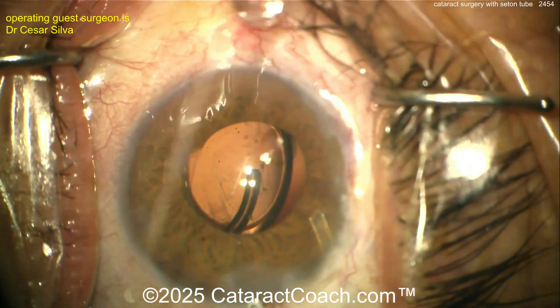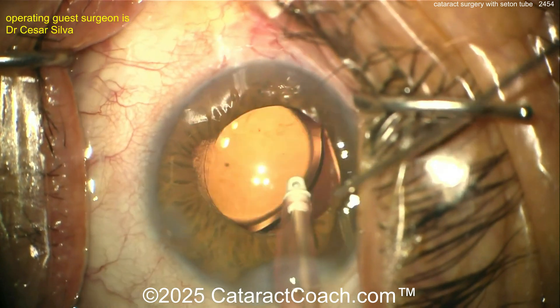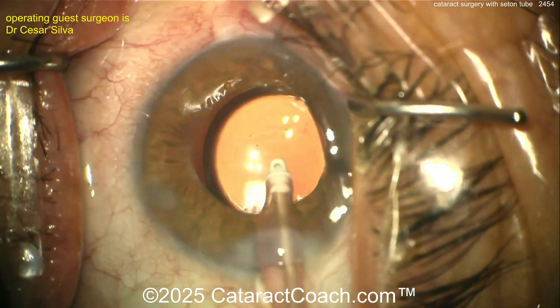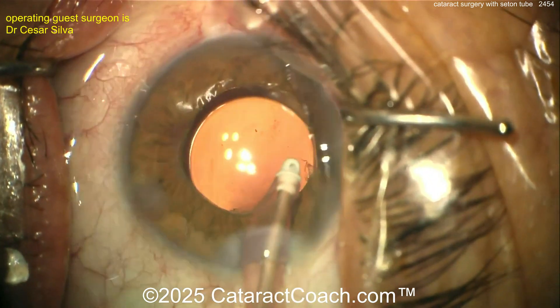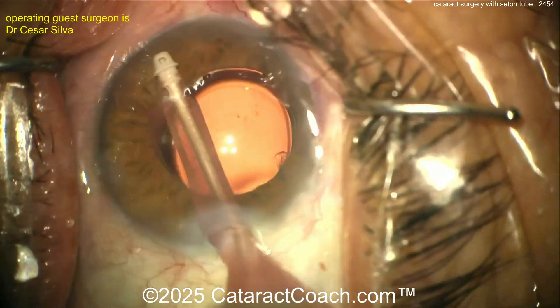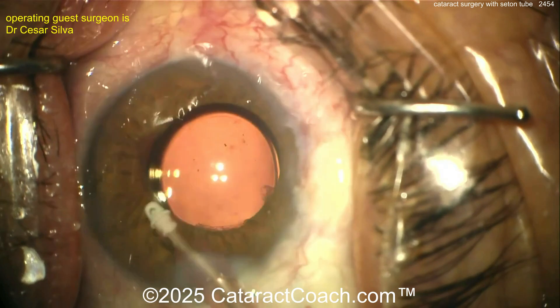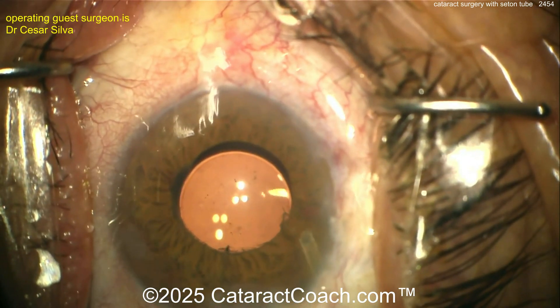Now going behind the optic to remove the viscoelastic — that's an important step, especially if you injected a lot of viscoelastic in or around that tube. Make sure you aspirate it out fully. You don't want viscoelastic clogging up that seton tube and impeding outflow. Nicely removed here, cleaning up all that viscoelastic and getting it out of the eye.